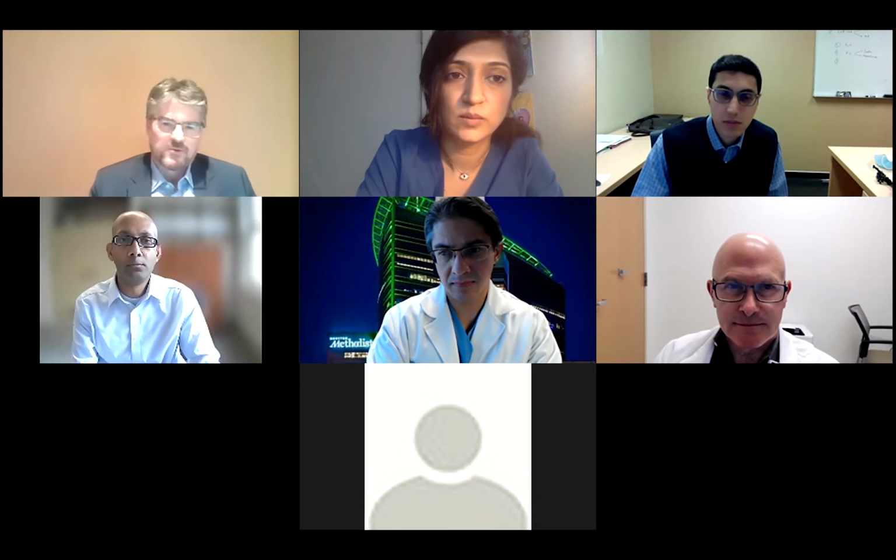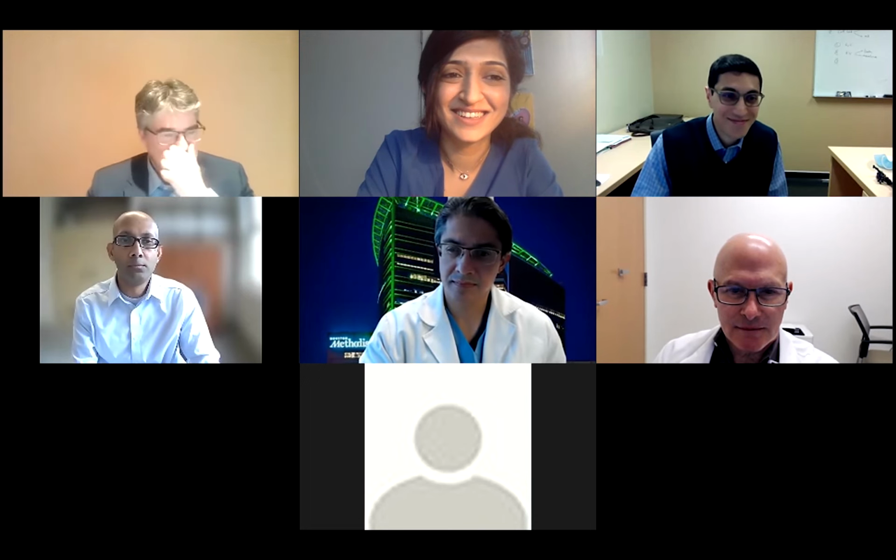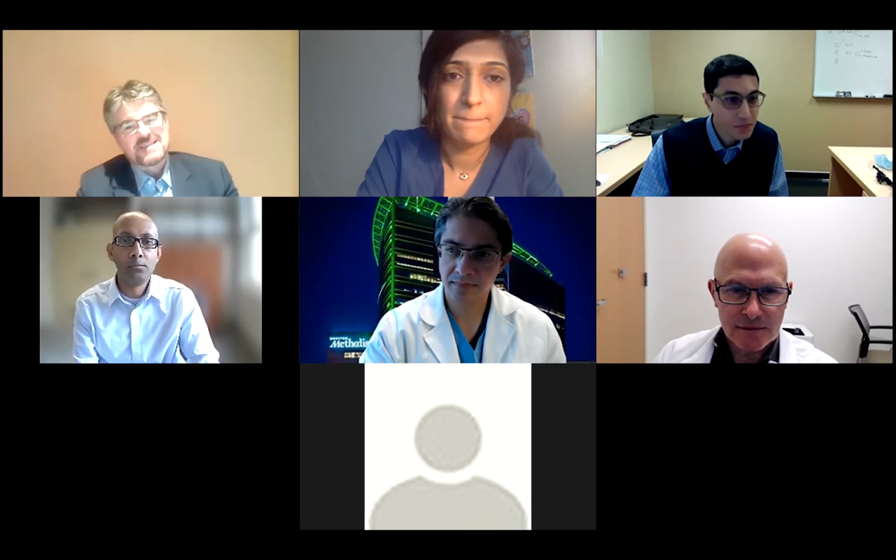I agree with all the points, and I really endorse what Dr. Kramer said at the outset, which is to also have rest perfusion imaging. I find that having rest perfusion to help rule out dark rim artifact is extremely useful. We don't do rest perfusion at all, but that's maybe our local specialty. Just one thing I wanted to add on triple vessel disease versus microvascular disease.